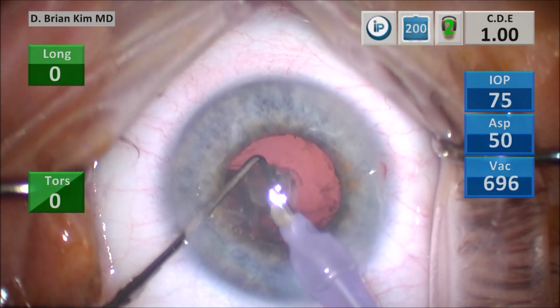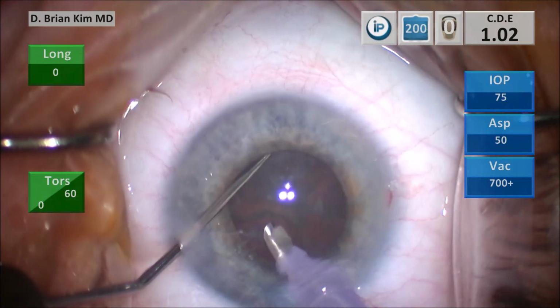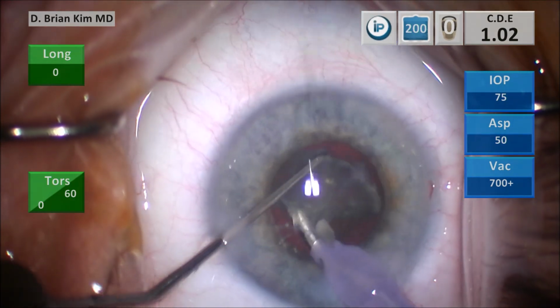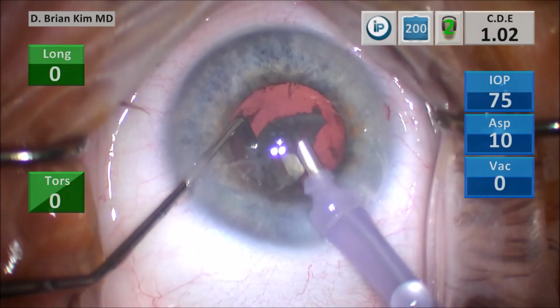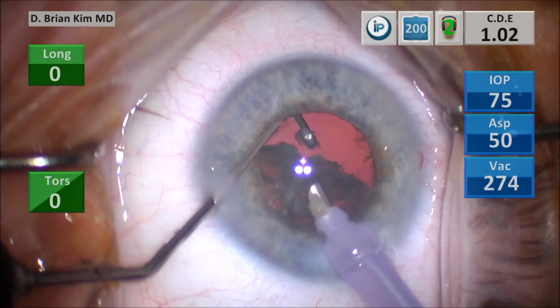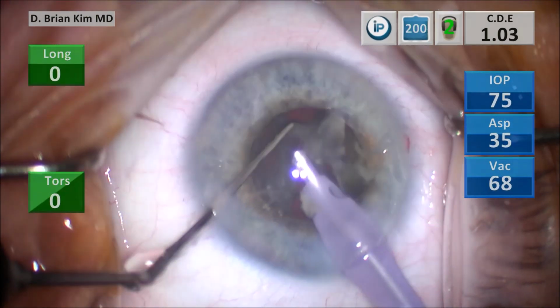I'm going to turn the fourth quadrant in front of me, place the chopper around it, place the phaco tip deep, crushing it in half. But you see it still doesn't want to completely separate. Again, this is just the nature of this sticky type of lens. I'm crushing the lens with the chopper against the phaco tip.